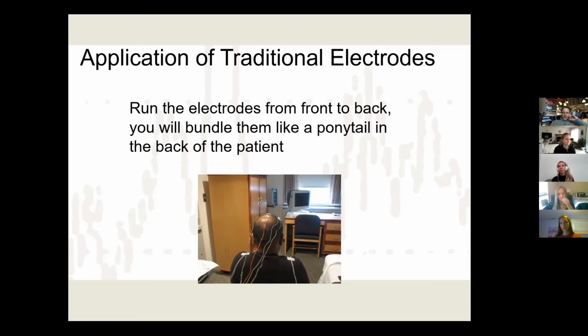As you get more experience, you'll start to see more what we're talking about, but especially people with really thick hair, if you think of your own part, it kind of poofs up. So it becomes important when you're trying to press the electrode down, and then the tensive glue is also serving to push that hair down so that the electrode can actually come in contact. But that's also what the paste is for, to create that contact, even if the electrode is poofed up and sitting a little bit up on the hair.